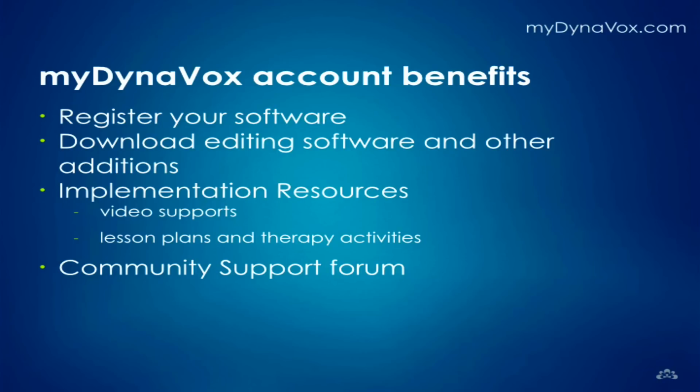If you want to download the editing software, the Compass editing software, you can do that from that MyDynavox website. There's also the implementation resources that I've mentioned, some lesson plans and therapy activities, along with a lot of video support. So if you're like me and you need to learn things visually, then the video supports are really helpful and show you some different tips on how to use the page sets that come with it, and how to do some of the actions like editing pages and things like that.